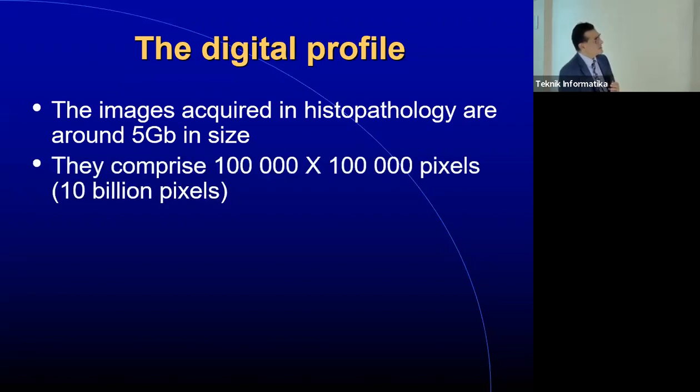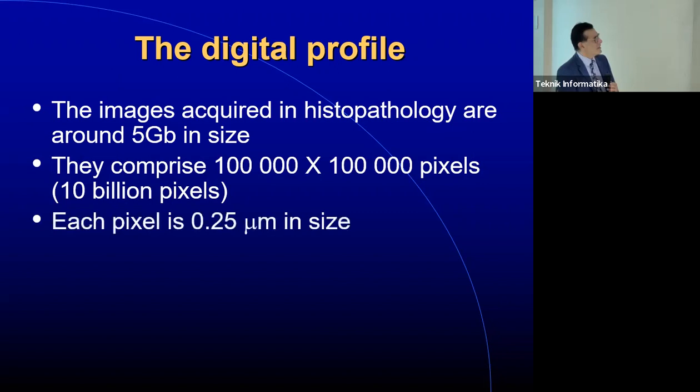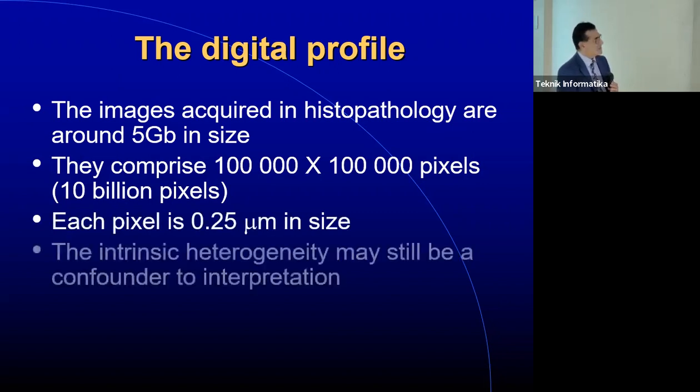They're usually 100,000 by 100,000 pixels. So you've got 10 billion pixels to be dealing with. Each pixel is 0.25 microns in size. So this is high resolution. Sorry, that's from the previous slide there.